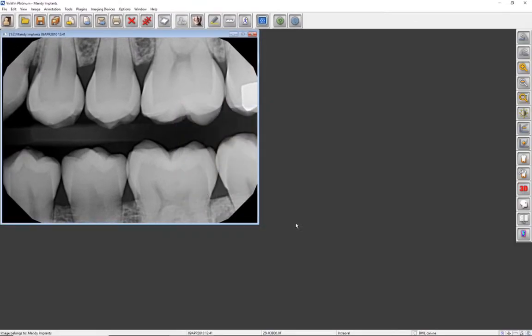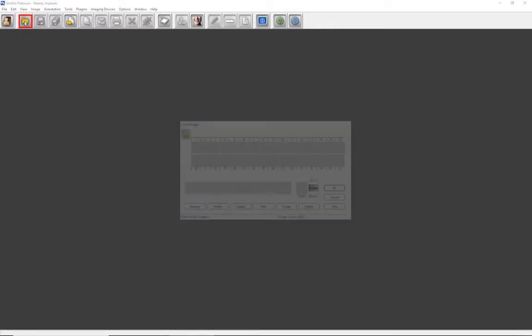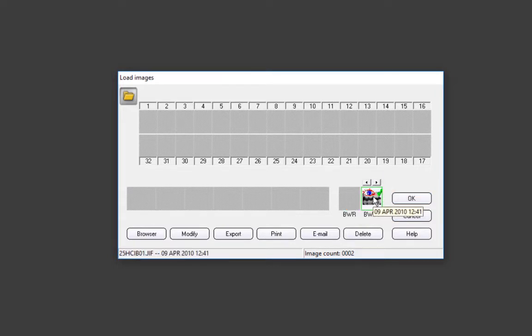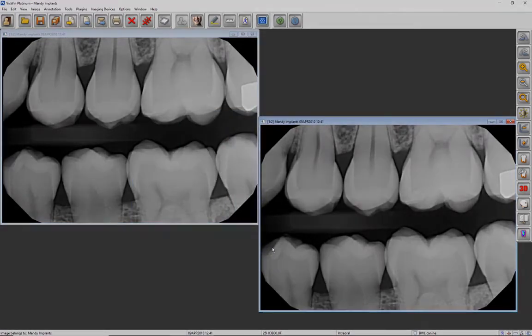If you would like to compare scans taken over time, it's easy to do. For demonstration purposes, I have saved a copy of the previously saved bite wing. Let's click the Load Images toolbar icon. Bite wings of the same dentition will be stacked and dated. Next, click on the visible bite wing. The eye indicates the last selected image. Click on the right or left arrow to go to the next image, click on it, then click OK. You can now click and drag the images to reveal the two bite wings for comparison purposes.